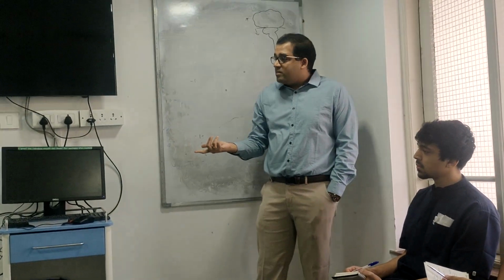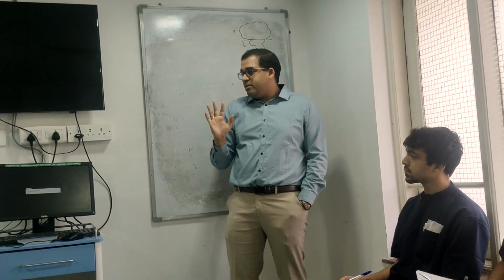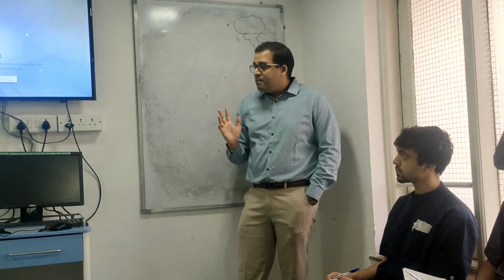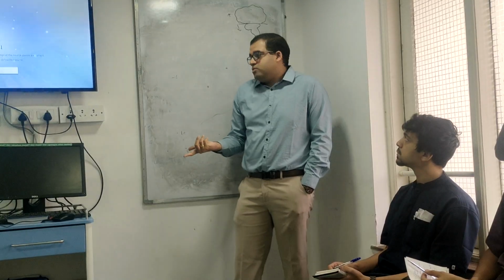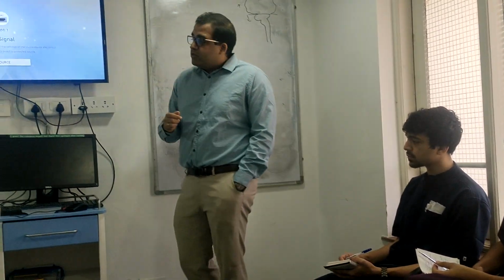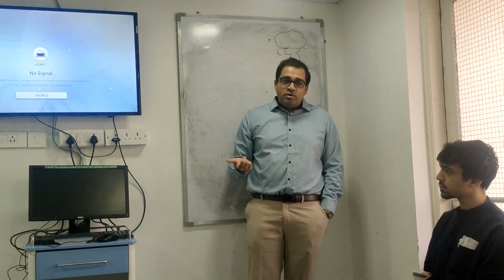There is no other source of contamination. अंदर sterile है, अंदर जाके कहीं पे system में कहीं पे भी contamination नहीं. So these two places you take care, contamination rates are very good. Okay, because one contaminated bottle is 3,000 rupees down the drain. There is no point in sending the sample. So avoid contamination. Now, how much sample to collect in one set and how much to put in each bottle?